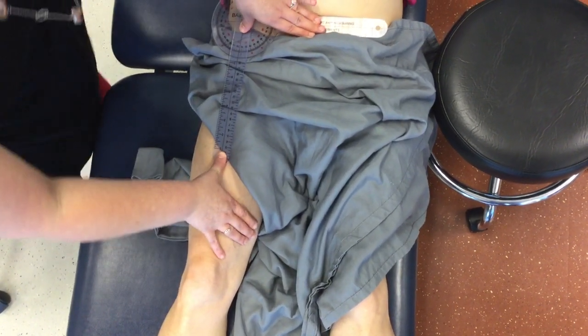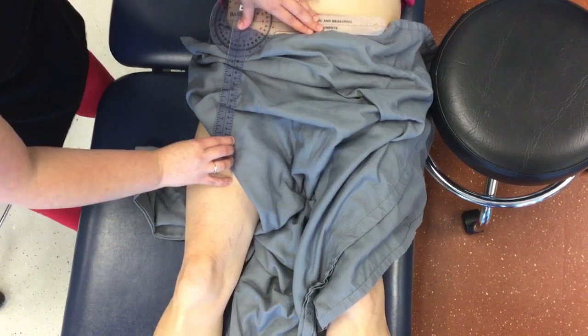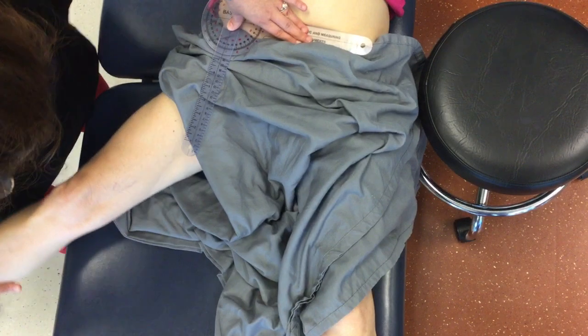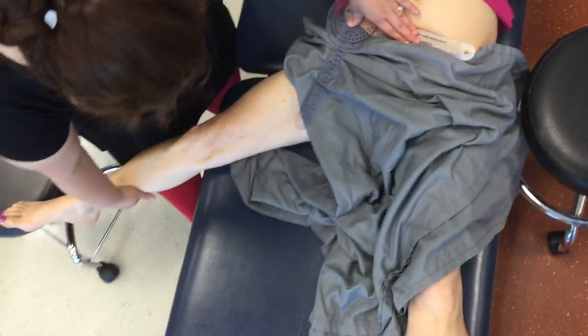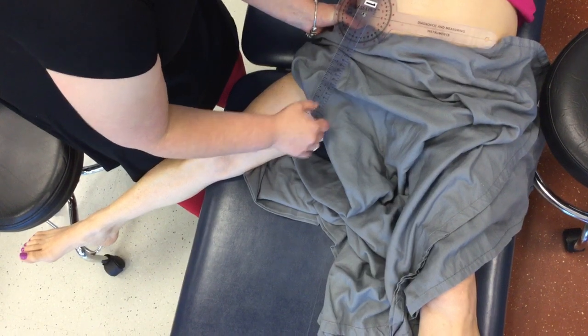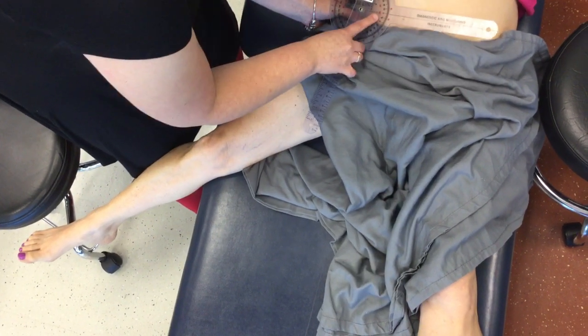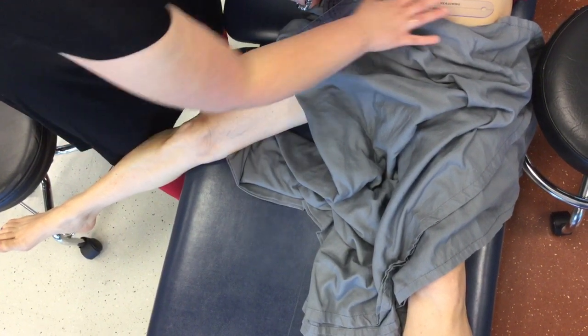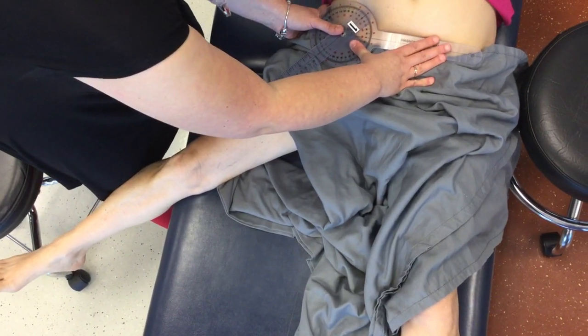Get your beginning measurement. Take your patient to end range. Palpate your landmarks and realign your goniometer and get your end measurement.